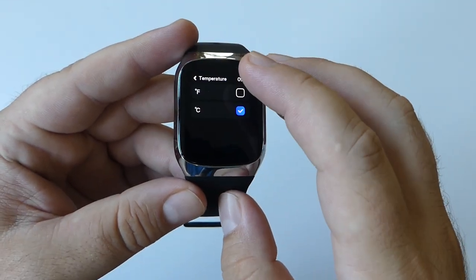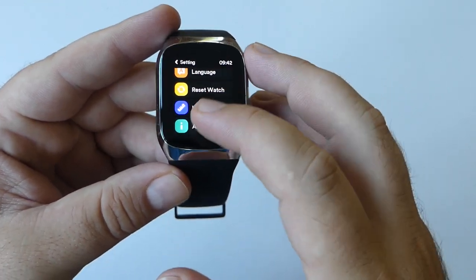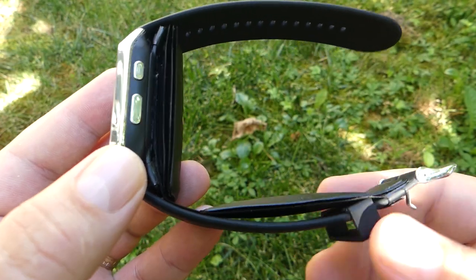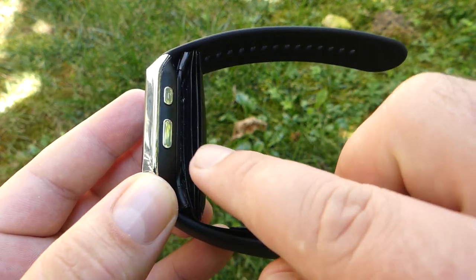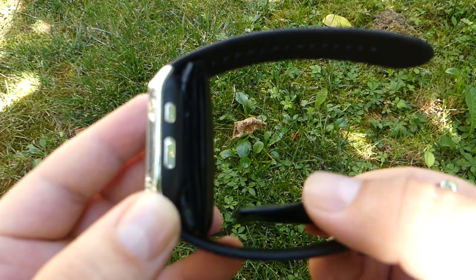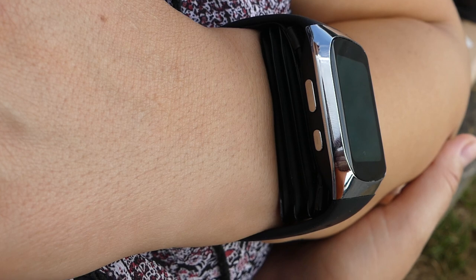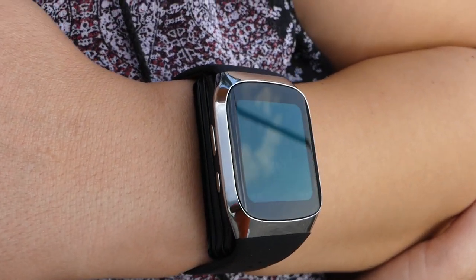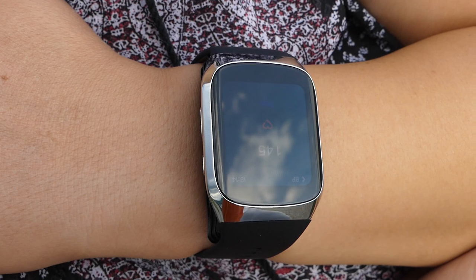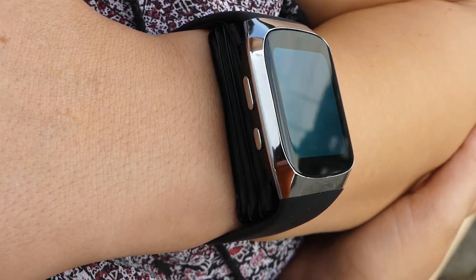Unlike other smartwatches, BP Dr. Med uses a patented design of inflatable dual cuffs arranged in the upper and lower portions of the watch strap. The cuffs automatically inflate while measuring to wrap your wrist completely, just like upper-arm BP cuffs used by doctors. This design provides accurate measurements and fast results.